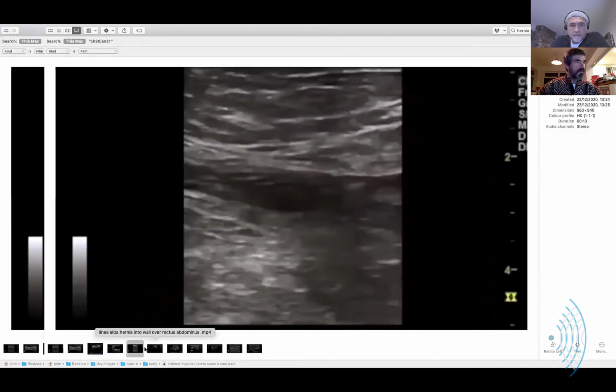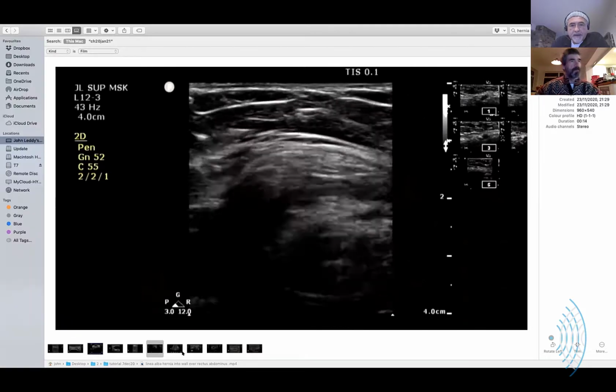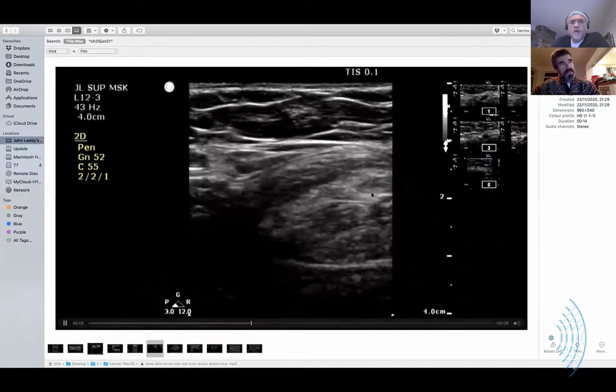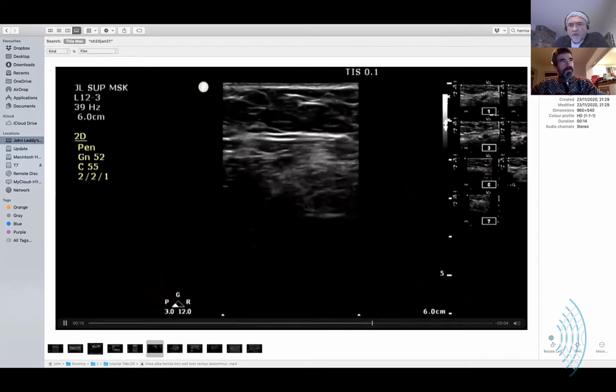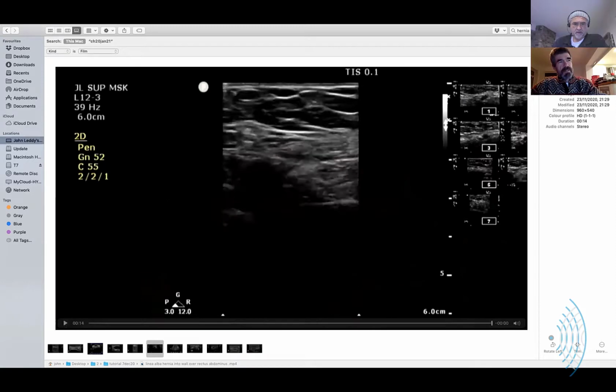That's an indirect. Okay, yeah. So can you see that? I can see the image. Yes. Now, ooh la la. Can you orient me to the fibers that are down? Is that the rectus on the right that you're over right now? Yeah, that's the left rectus abdominis.